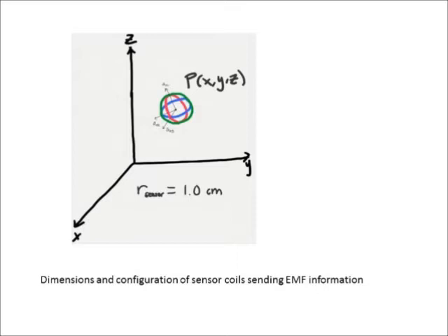Once the matrix of EMFs is generated, optimization techniques are needed in order to find the position from the EMFs. In order to obtain our results, the built-in Matlab optimization tool was used. The optimization tool is a graphical user interface for a built-in fmincon function, which is an optimization solver for constrained problems.